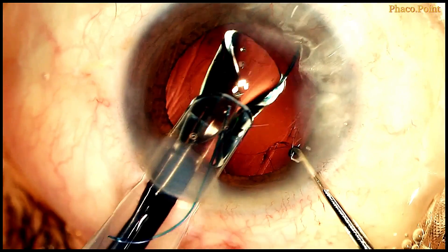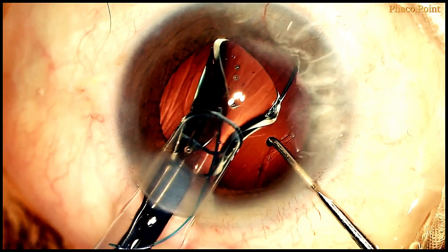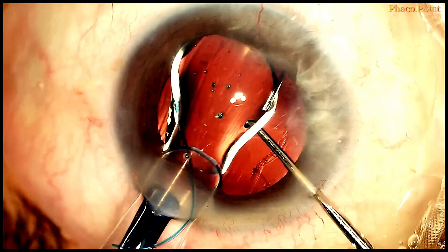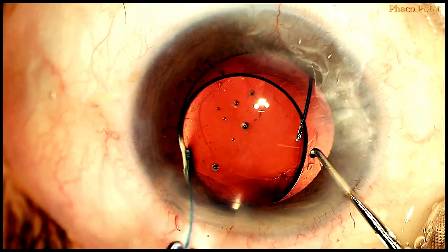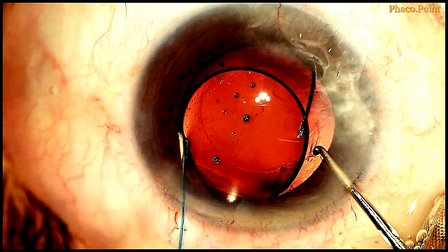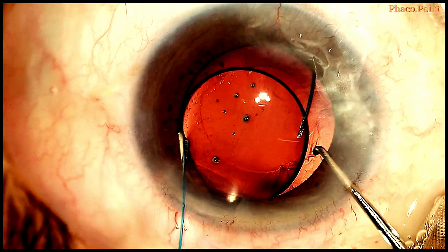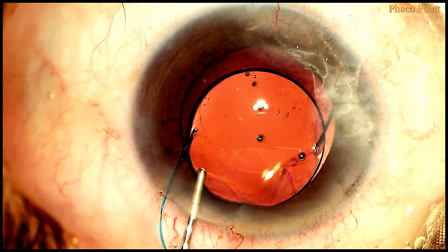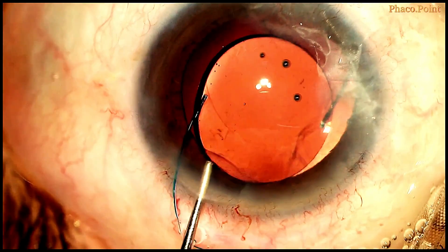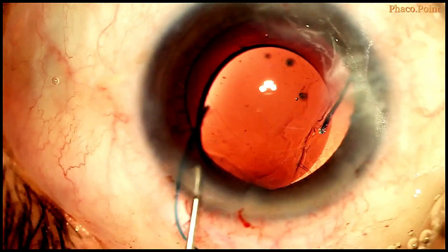Once the leading haptic is in the ciliary sulcus, the rest of the optic is injected into the anterior chamber. As mentioned earlier, the trailing haptic is injected almost always outside the eye. Some more viscoelastic is always introduced into the anterior chamber.